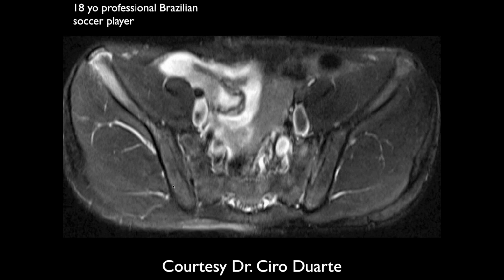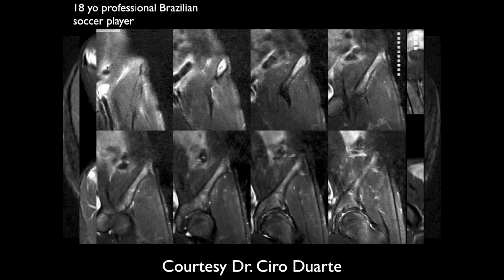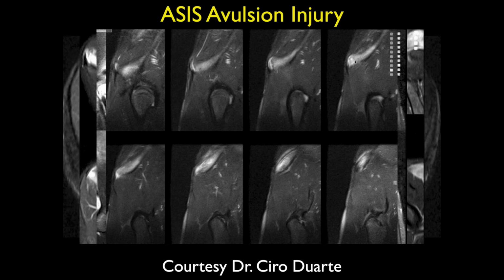Okay, so we have an 18-year-old professional soccer player. Here again, we can see a non-displaced osseous avulsion injury of the Sartorius attachment at the anterior superior iliac spine. It may be chronic. There's a lot of edema, but it's minimally displaced. We can see the surrounding marrow edema and minimally displaced avulsion injury.